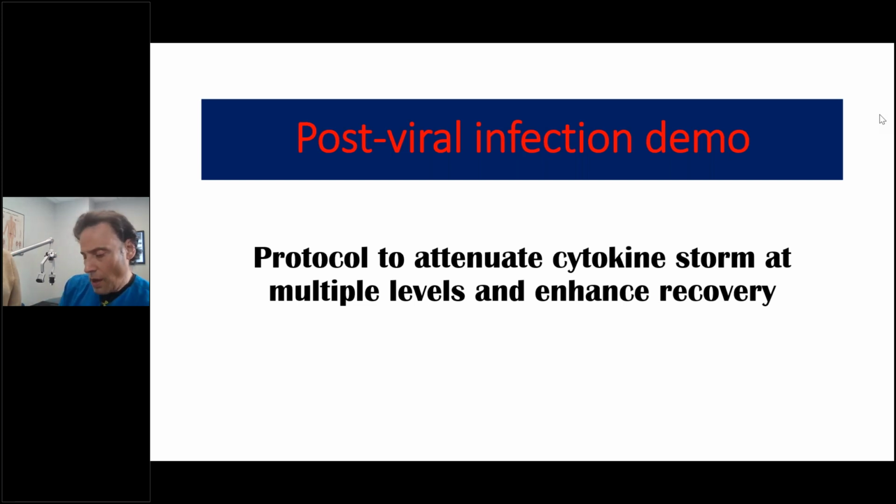And I'm going to go back in here. I'm going to go back. I'm going to go here, user mode. I'm going to go to red and violet. And hopefully you can all see, I'm going to go in the lower right quadrant to stimulate what we call the migrating motor complex and the ileocecal valve, which are typically implicated when the tone of the vagus nerve is decreased.